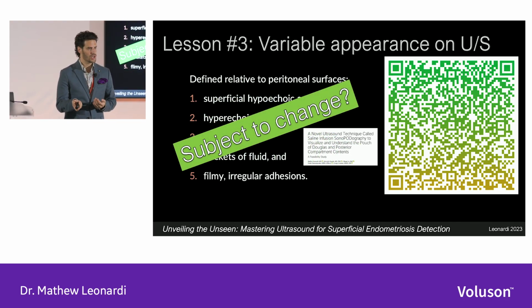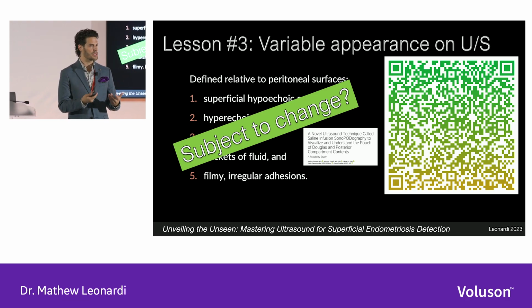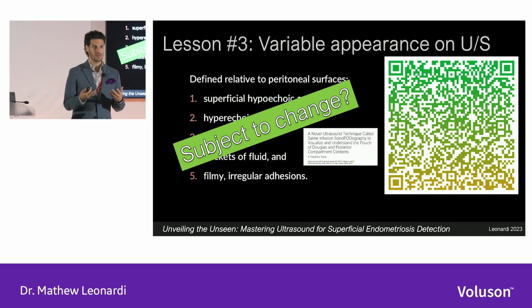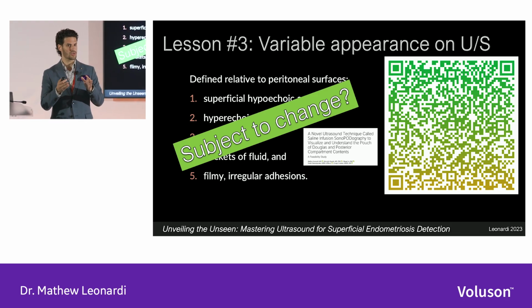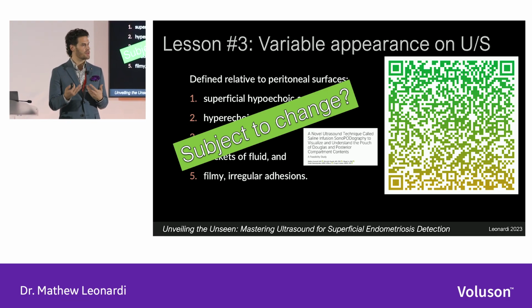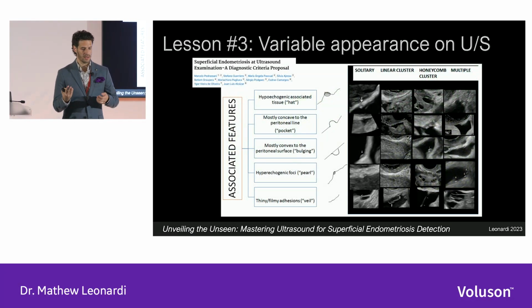Just like the definition of superficial and deep endometriosis has changed, I think how we describe superficial endometriosis is also subject to change. This was the first, as far as I know, depiction in a study that described the sonographic features, but maybe there are going to be evolutions in our understanding of this. And in fact, there have been.